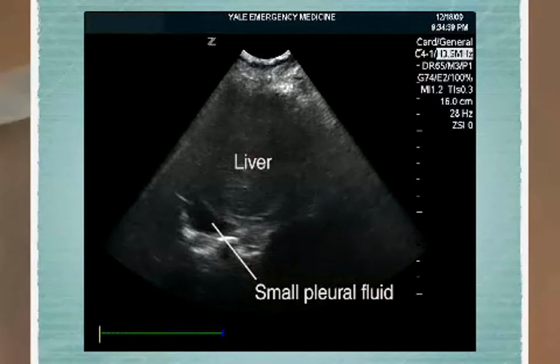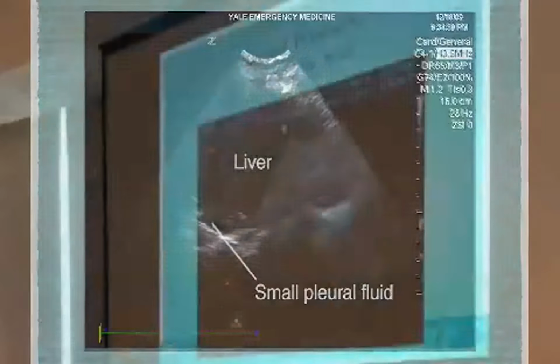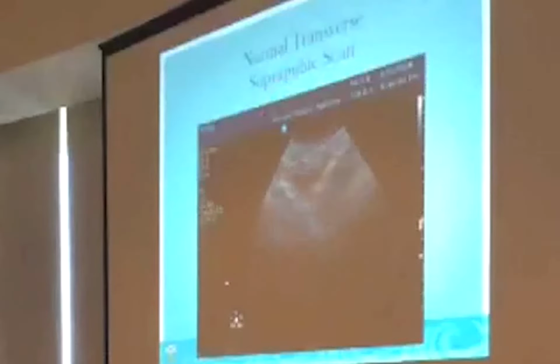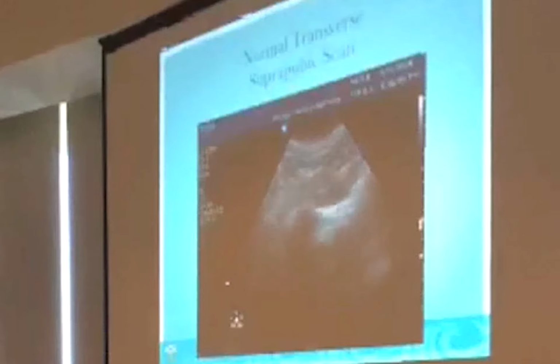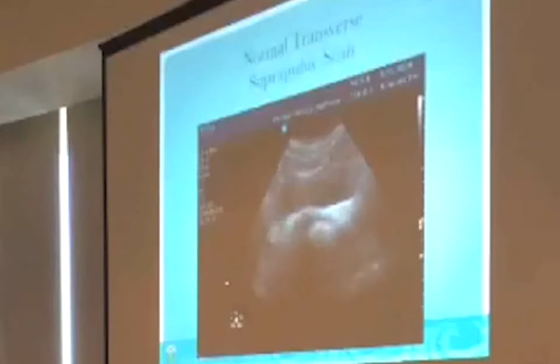This is a normal scan of the pelvic view in transverse orientation. It's kind of rhomboid. This is a fast-moving slide, but it demonstrates that you can't just put your probe in the middle of the bladder and call it a day. You can put your probe in the middle of the bladder and optimize your picture so you're confident about what you're seeing. But then you must scan all the way through. So fan all the way to the end of that organ and then all the way the other way so that you're seeing the whole backside of it and not just one little segment.